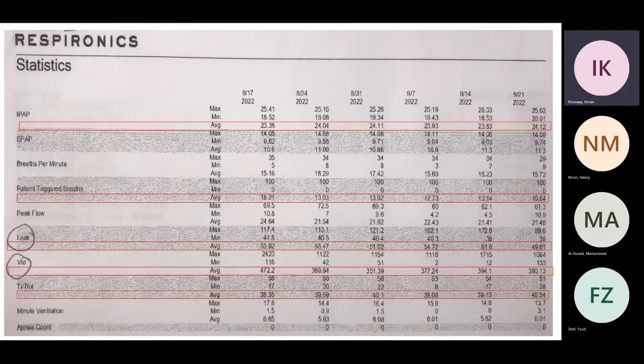But in neuromuscular disease, if the patient themselves, without you using a higher rate, have an acceptable backup rate and this number is on the low side, and you see it declining each time, this is a sign that their disease is getting worse. This is to answer your question.